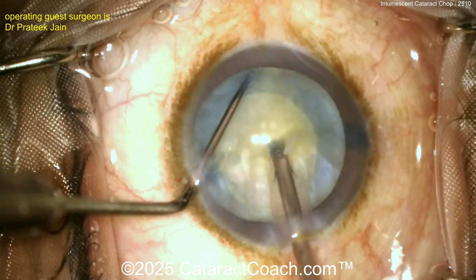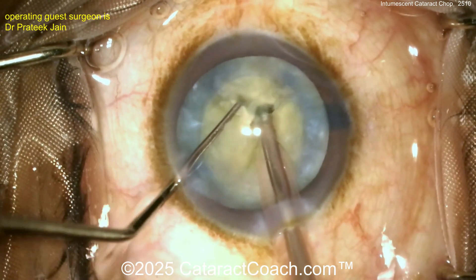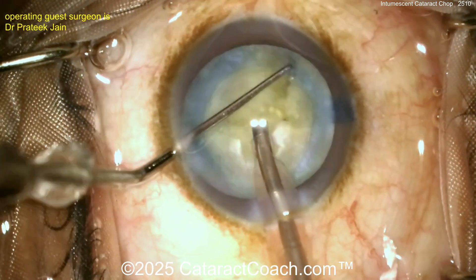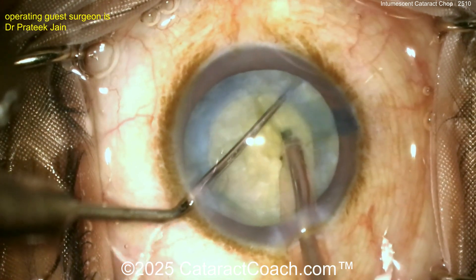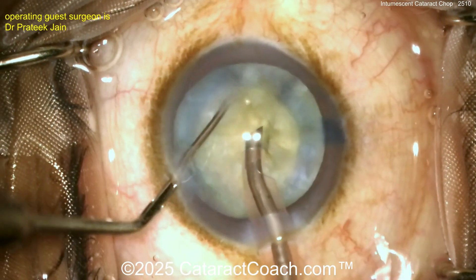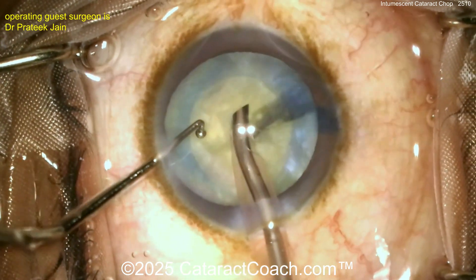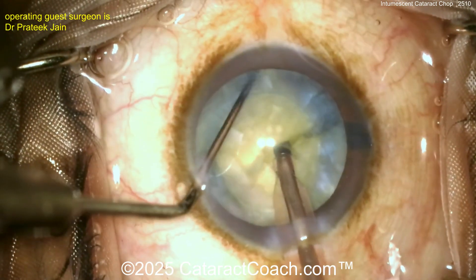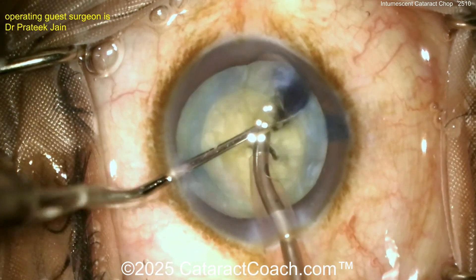You need about a 90-degree rotation here — here's another chop, looking good. Rotate, rotate, rotate — chop again. The surgeon is doing a beautiful job with a lot of chops. Look at that ball-tip chopper for horizontal chopping — you're not going to do a vertical chop with this, I promise you. There's the horizontal chop.